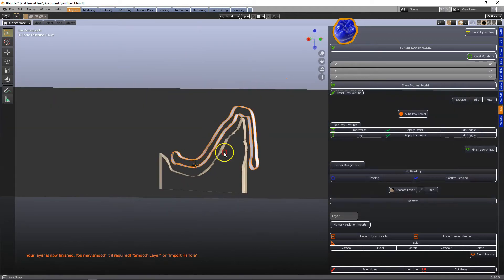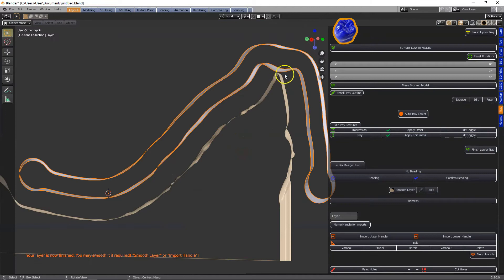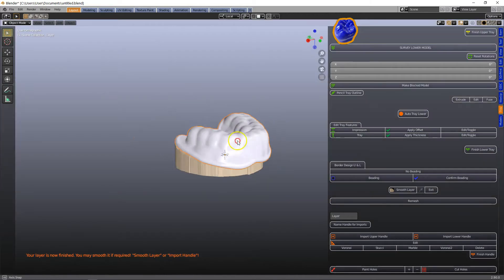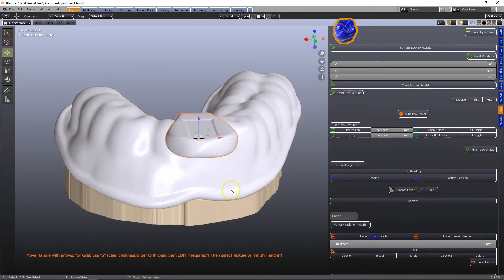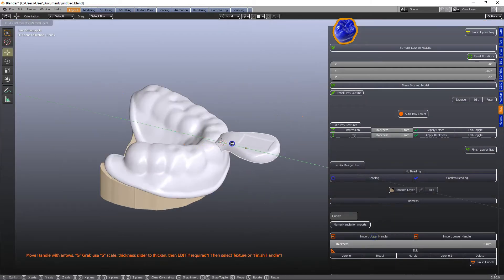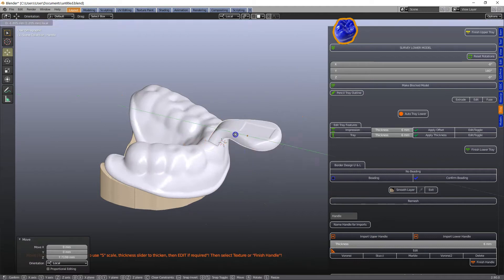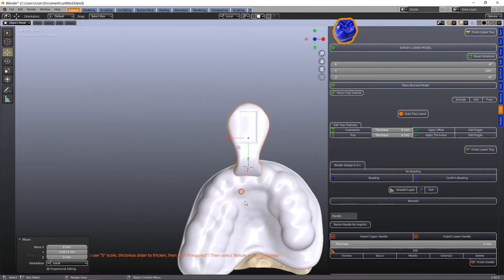Alt-B to show you where the occlusal incisal stop is. Next we're going to place our tray handle.